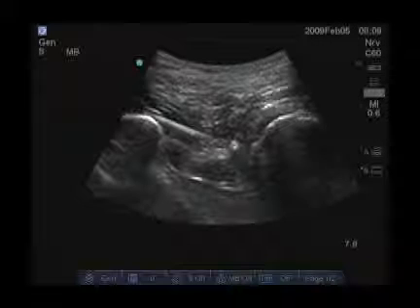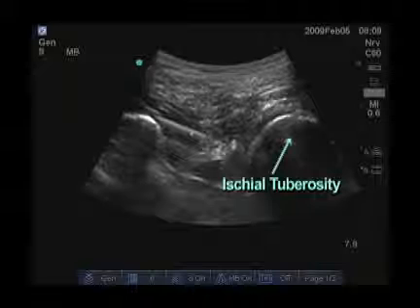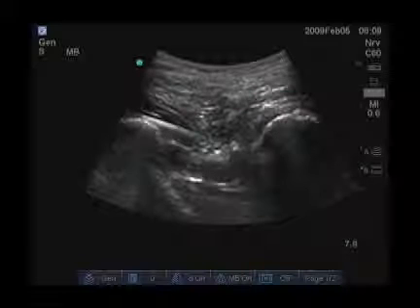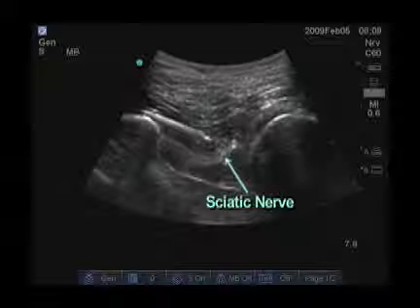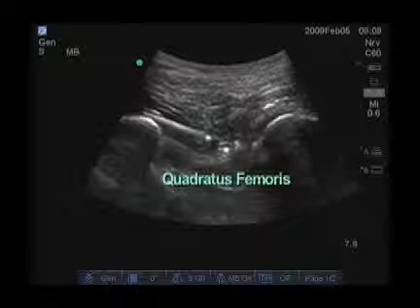Here you can see the greater trochanter on the left side of the screen, the ischial tuberosity on the right side of the screen, the gluteus maximus superficial, and a 21 gauge needle advancing to the sciatic nerve. The sciatic nerve is below the gluteus maximus and above the quadratus femoris.